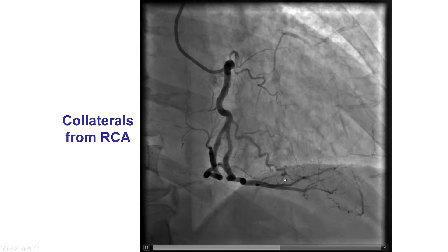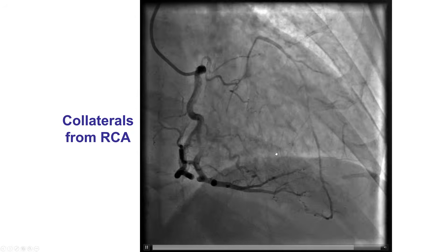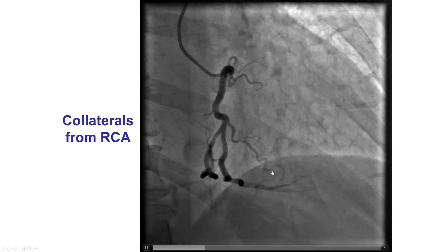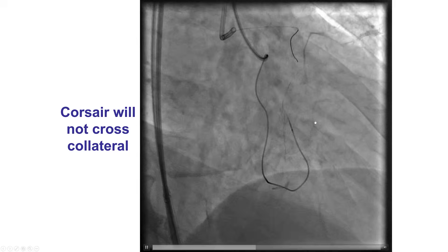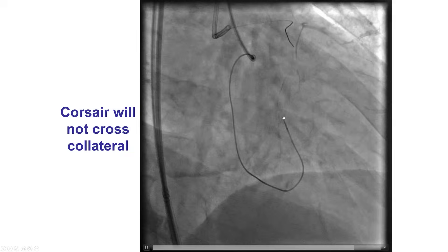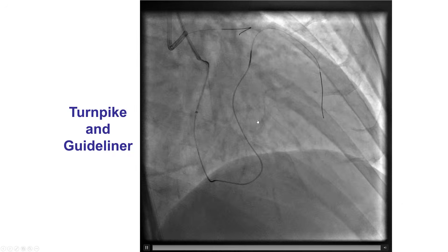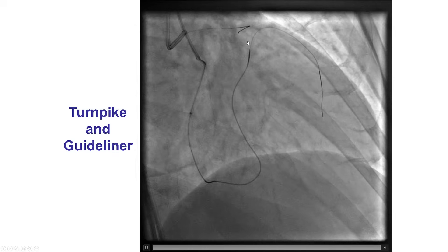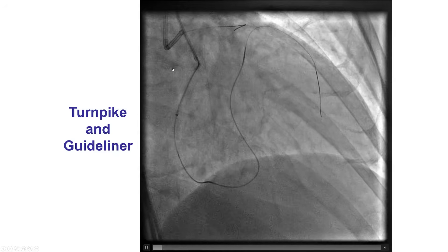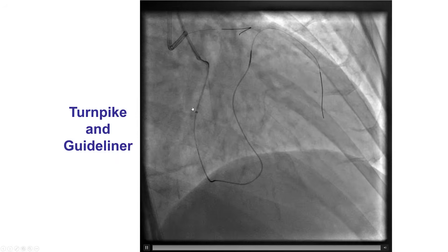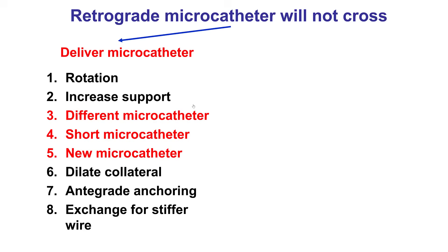This is an example of a patient with an LAD CTO and septal collaterals from the right coronary artery. The microcatheter could only be advanced to the middle segment of the septal collateral. But then after inserting a GuideLiner, the microcatheter could be delivered all the way to the distal true lumen. Extra support with a guide extension can improve the likelihood of advancing the microcatheter through the collateral.